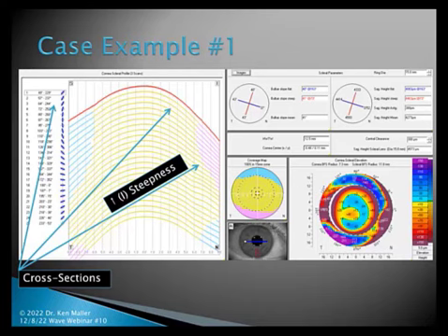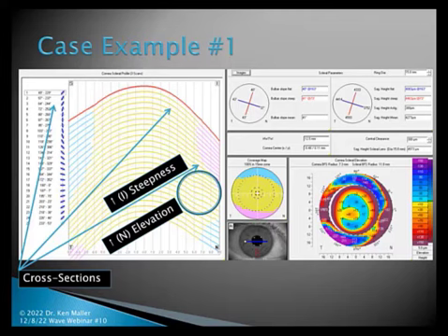That's because of the steepness of the inferior portion of this particular sclera. You'll also notice that the nasal side, where those yellowish golden arcs are, is much, much flatter and considerably more elevated. Again, it's an 18-millimeter capture that I was able to capture there.